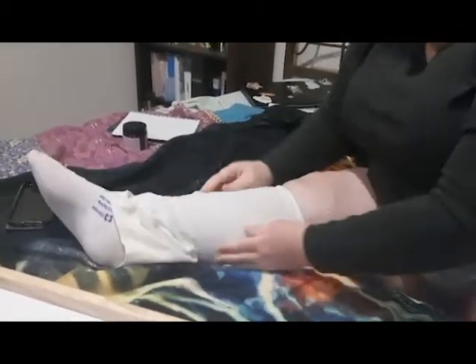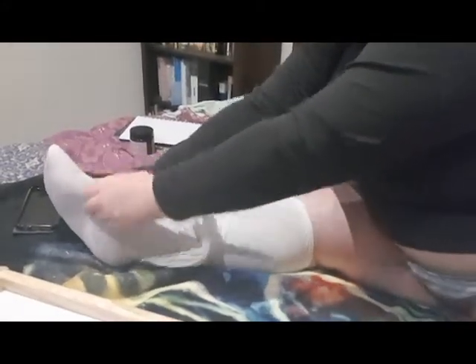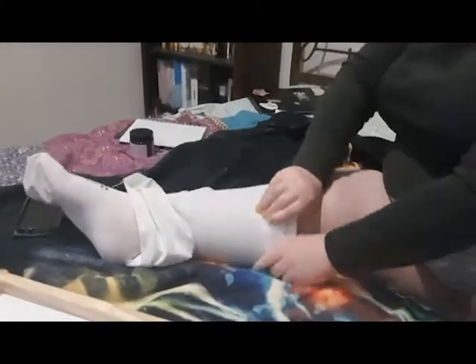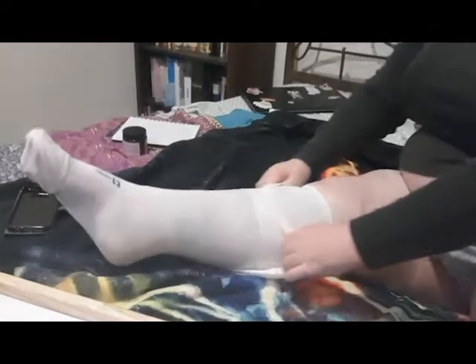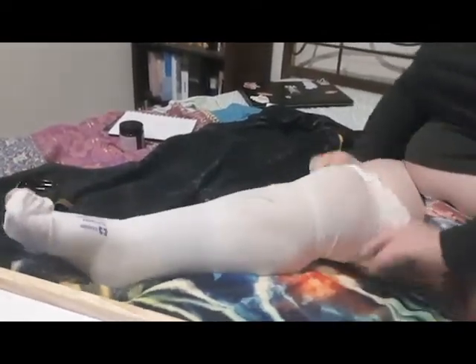I have ripped through a few different compression stockings, so try to gently ease it around so that it's not twisted, because if it's twisted, you're going to find that it will want to twist further when you're wearing it and as you move around. So we just keep grabbing it, pulling it up.